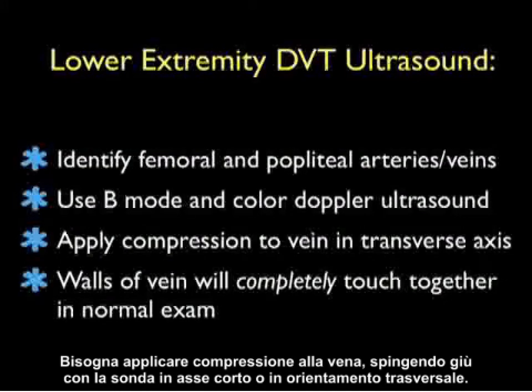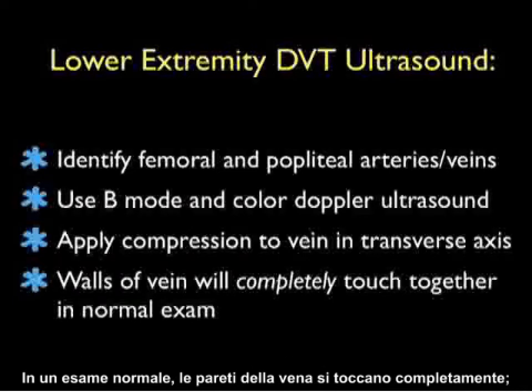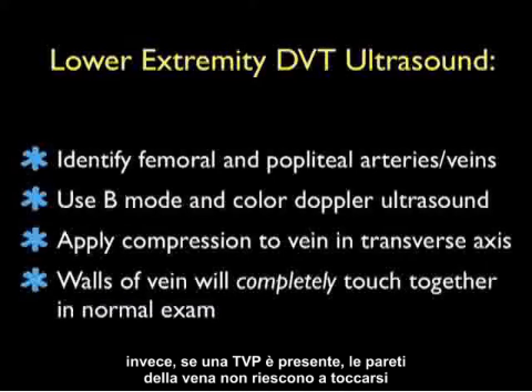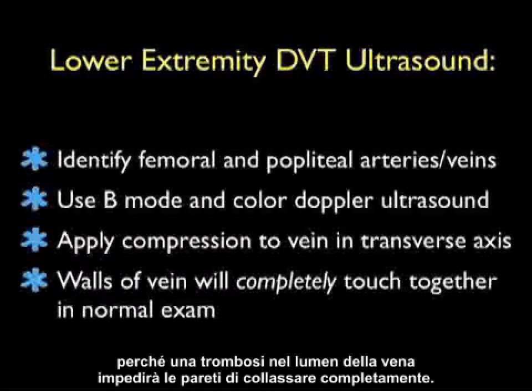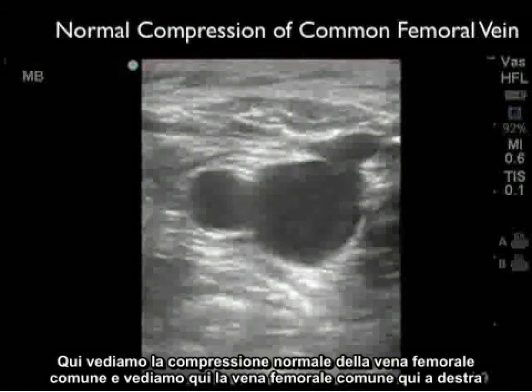We want to apply compression to the vein, pressing down with the probe in the short axis or transverse orientation. In a normal examination, the walls of the vein will completely touch together. Conversely, if a DVT is present, the walls of the vein will not completely touch together, as a thrombus within the lumen of the vein will prevent the walls from completely collapsing.